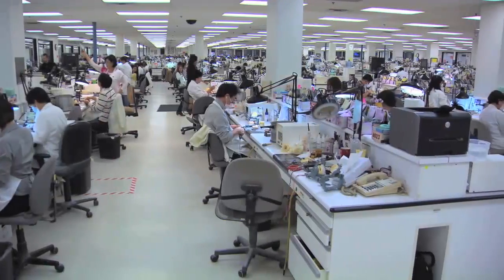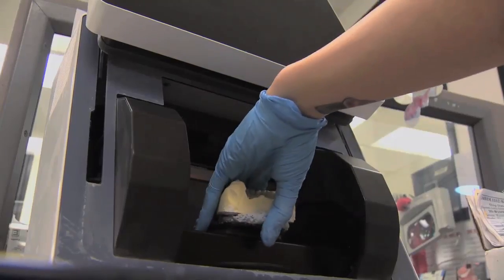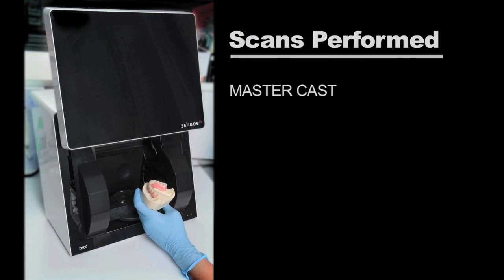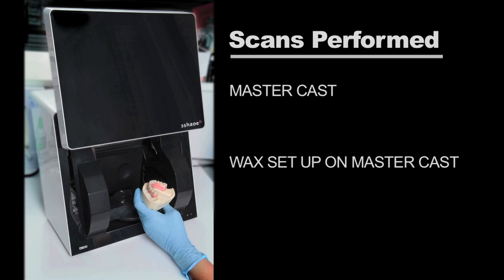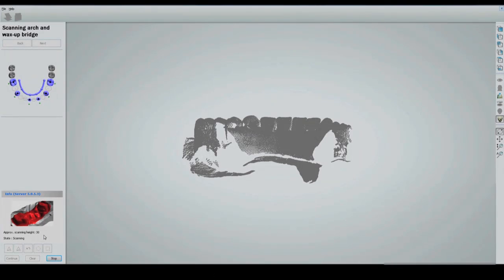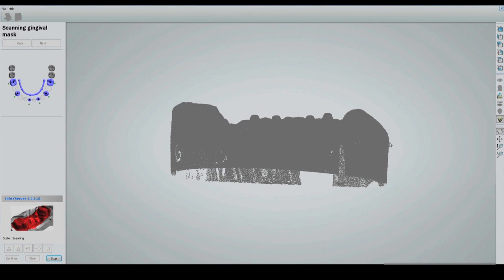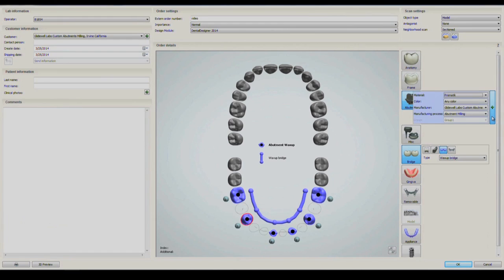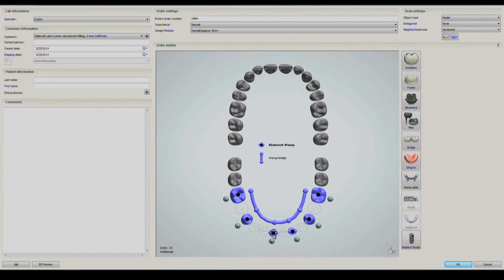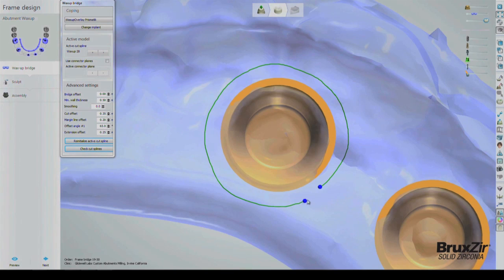Beginning from when the lab receives the doctor-approved setup, multiple scans are performed, including the MasterCast, the wax setup on the MasterCast, and the MasterCast with scanning abutments in place. The CAD-CAM software automatically combines the digital data collected in these scans to produce a highly accurate digital rendering of the MasterCast and final setup, including the positioning and orientation of the implants.